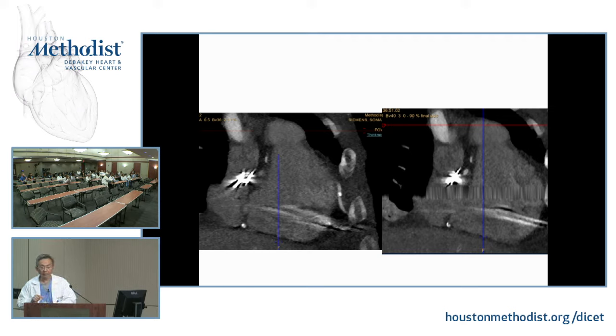No? We are stumped. Just the image quality. How is it? Does it look nice? Yeah, no, it's grainy. It's horrible. Less signal, right? Yeah, noise, right? Exactly. Usually due to either not enough contrast. Here it's hard to tell.